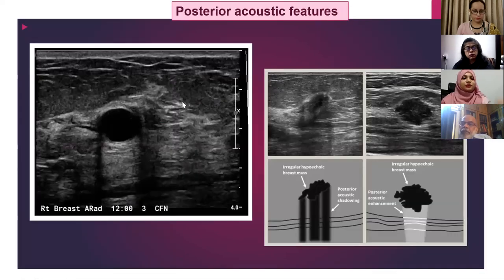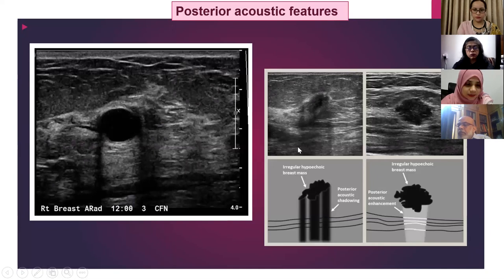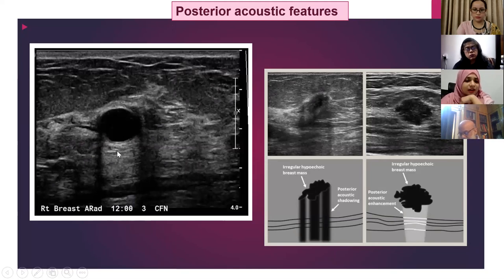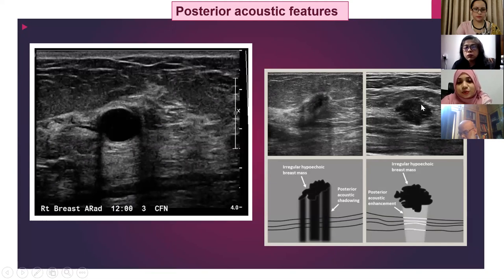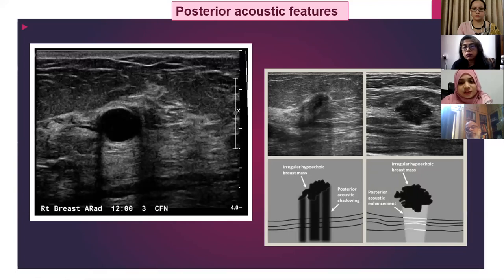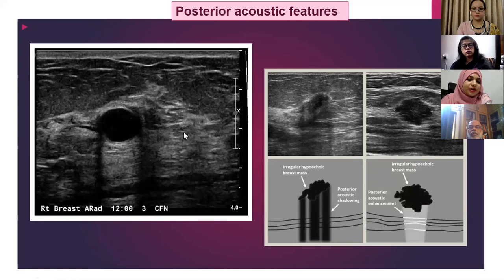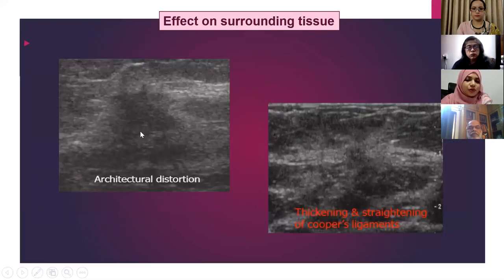Regarding posterior acoustic features, there are two types: posterior acoustic enhancement and posterior acoustic shadowing. We might assume that posterior acoustic enhancement always indicates a cystic lesion, but this is not always true. Very hypercellular tumors can also produce enhancement. Regarding the effect on surrounding breast tissue, there can be architectural distortion, thickening and straightening of Cooper's ligament, skin thickening, or skin retraction.